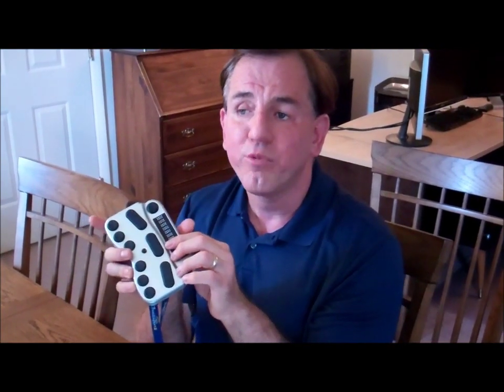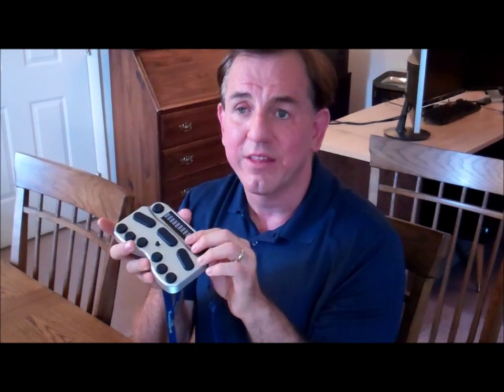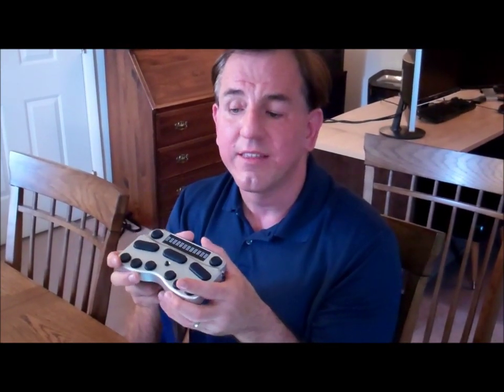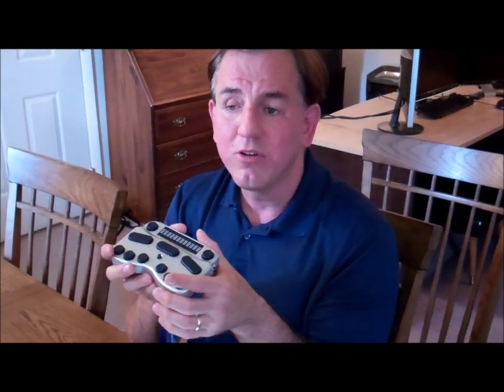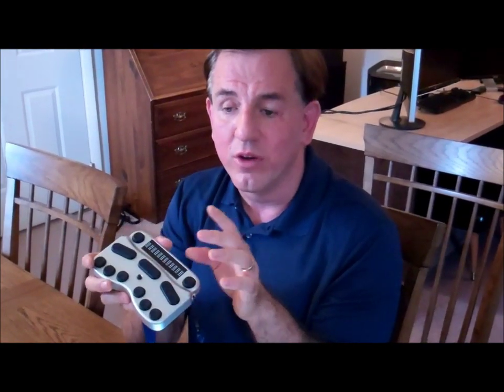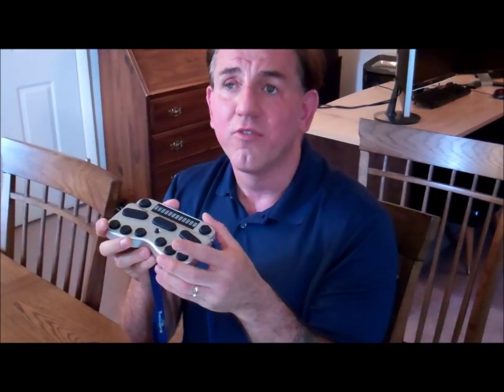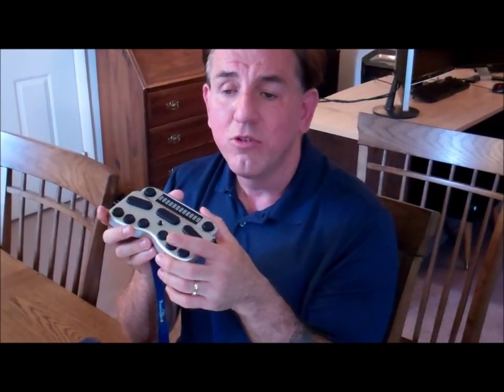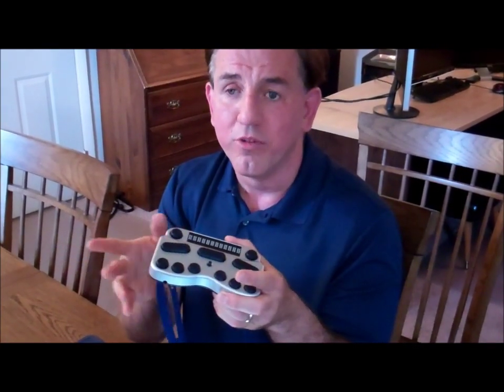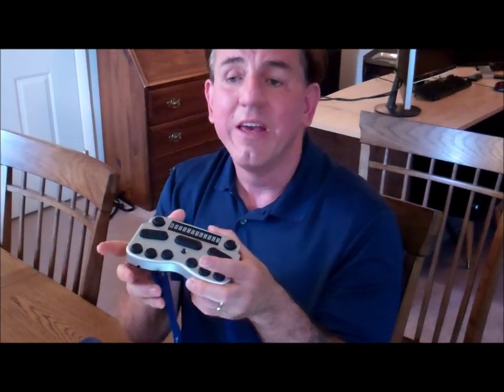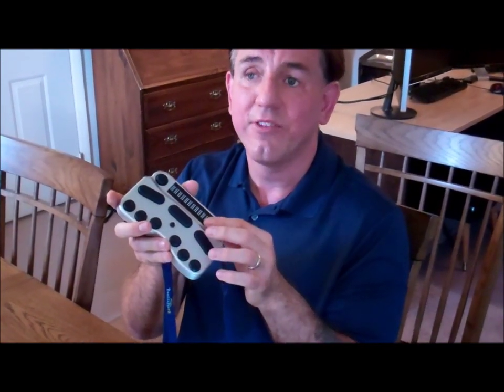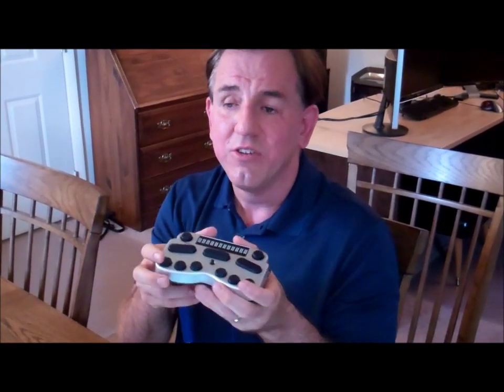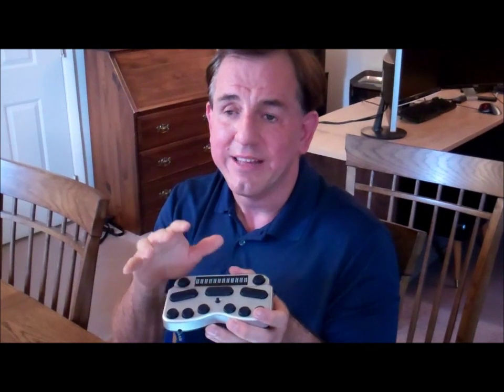In brief, Braille Pen 12 works with a number of different types of devices. You can use it with a PC running System Access screen reader, with a Macintosh using VoiceOver, with MobileSpeak or Talks phones, and with Android phones using mobile accessibility. But today, we're going to focus very heavily on using this product with the iPad.